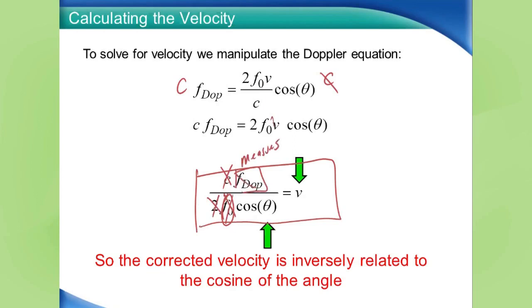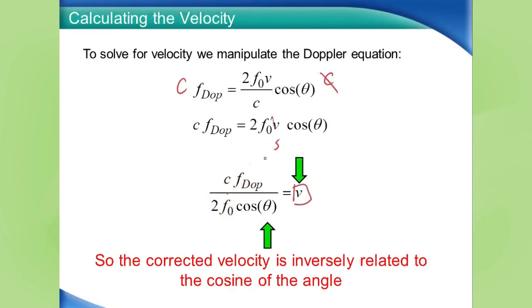So we know this as well from the measurement. So that only leaves the cosine of the angle theta. And if we know that, we can tell you what the velocity of the blood is. And this is what I want you to remember as we go through the lecture: when we apply an angle correction for the velocity, we do so by dividing the Doppler shift we measure by the cosine of the angle.